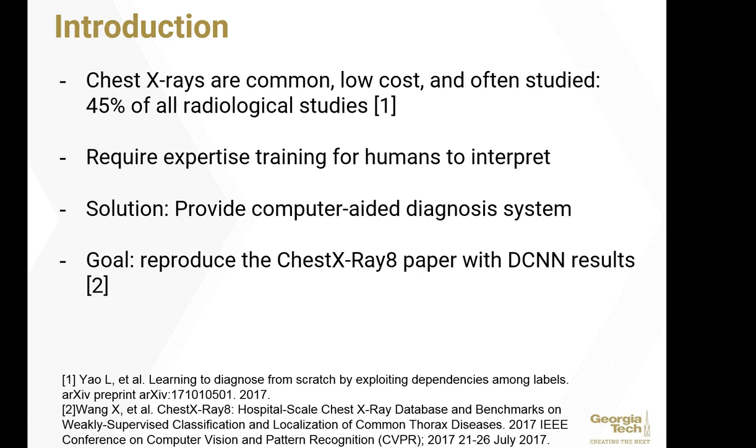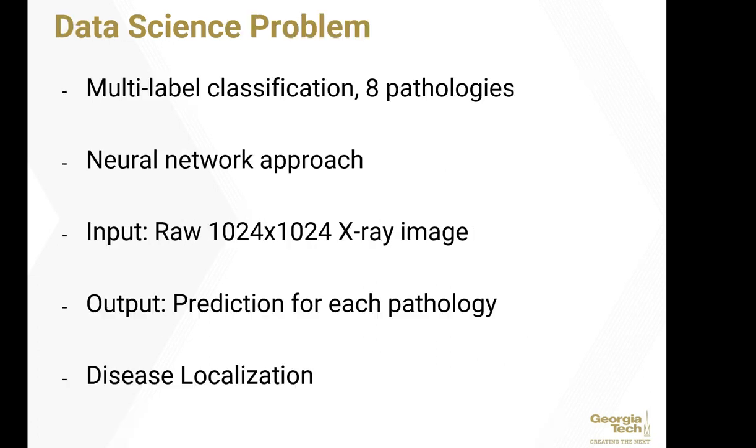Distinguishing various complex chest pathologies is very difficult even for a casual human observer, and there is a relative lack of radiology interpretation expertise. Computer-aided diagnosis can help practitioners in labeling and localizing disease.